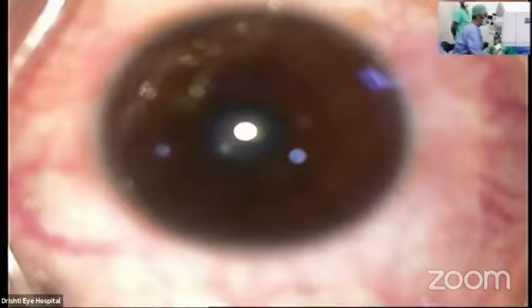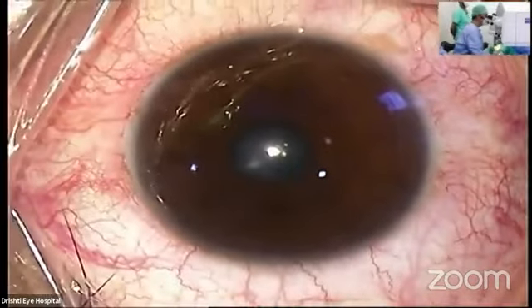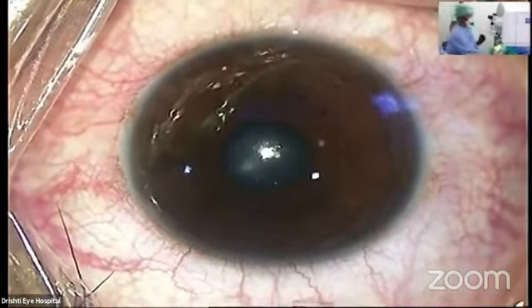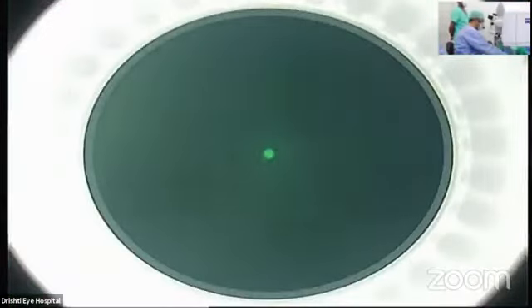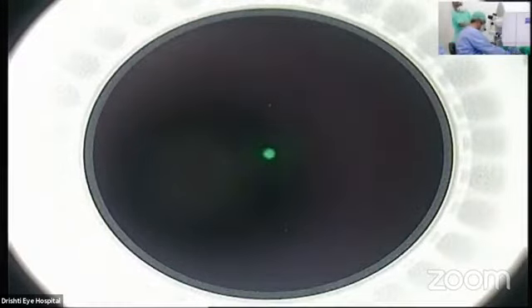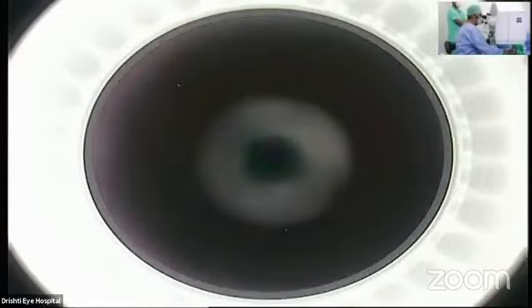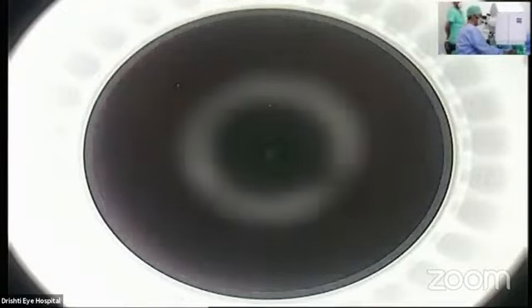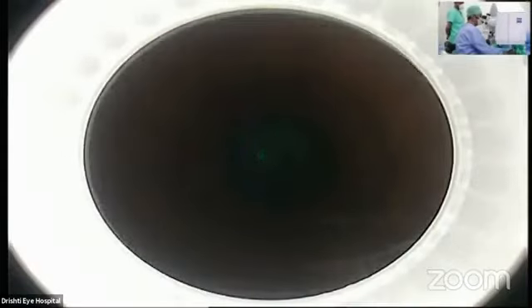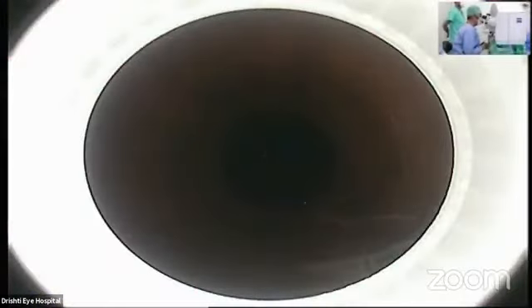Once that is focused, we are all set. We have already primed the pack and now we will be going on with the second step of the procedure. You will be able to see a small green light — you have to look into the green light. The most important part of doing SMILE is to keep talking to the patient and guiding them on what to expect. I am going to be talking to the patient so we can all keep hearing. You will see a small green light blink and I am going to count till 20. You will be able to see the green light till the count of 10 and you have to only look at that green light.